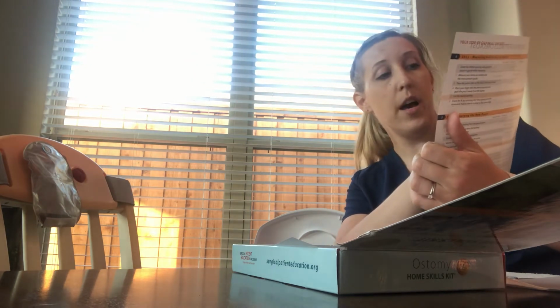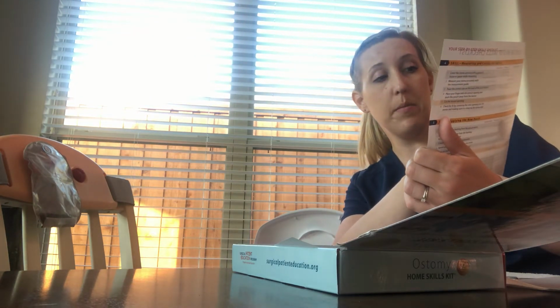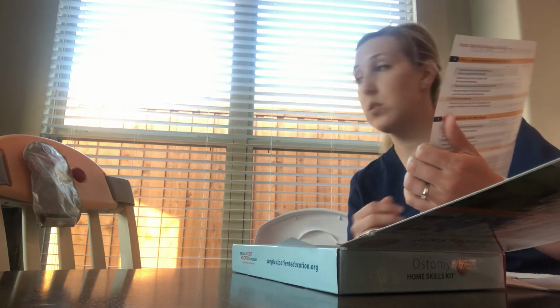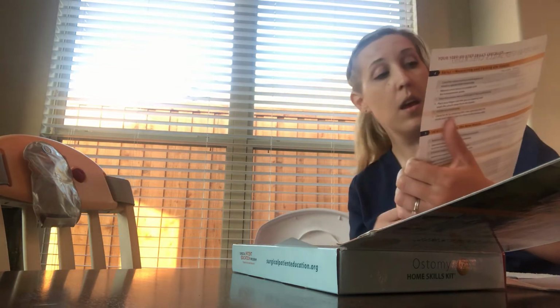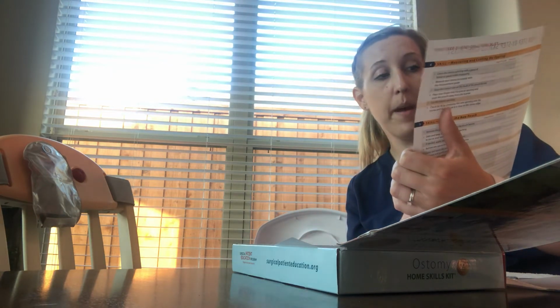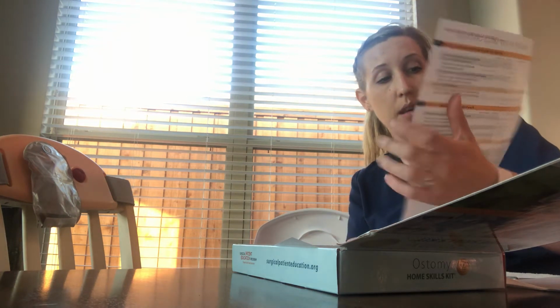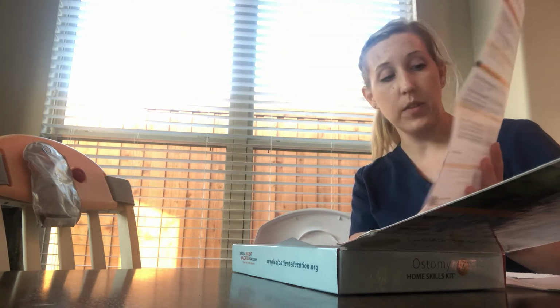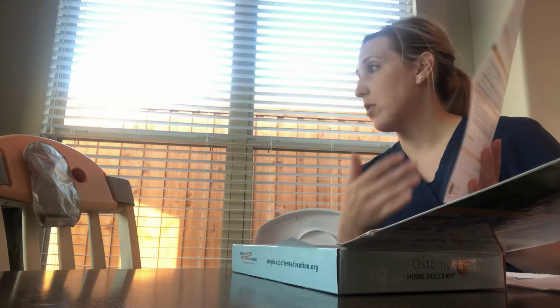and you want to empty it when it's about a third to halfway full. Make sure that you assemble your supplies before emptying, so get toilet paper and the pouch, assume the correct position on the toilet, raise and open the pouch, then lower it and empty into the toilet. It also talks about how to remove the old pouch, making sure that you have the supplies for that, and making sure that you place your old pouch in the garbage.